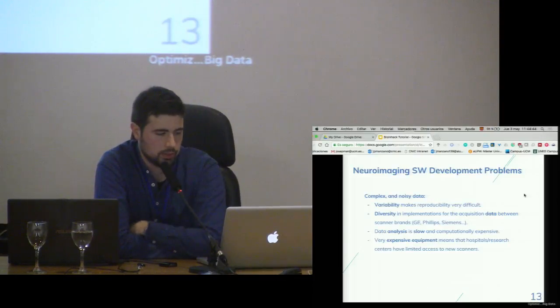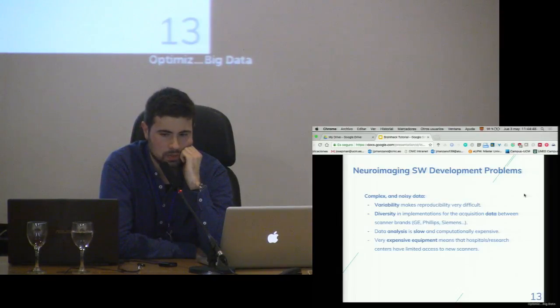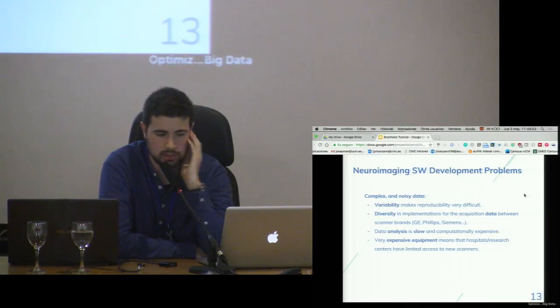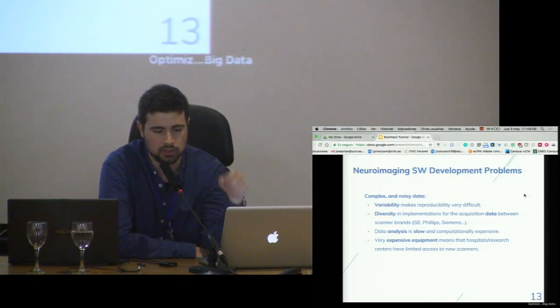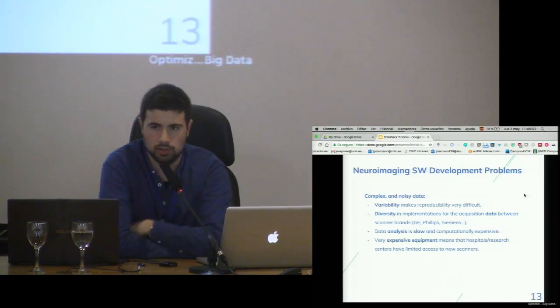Okay, so the typical problems with this data is that it's super noisy. It is also that the brands that create the scanners do not deal with the data the same way. They produce data like metadata that's different. So there is not a consensus, not a kind of common ground. Although there are standards, those standards are really ambiguous in the sense of format.